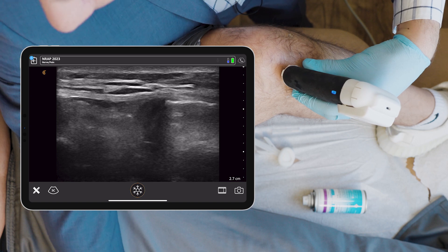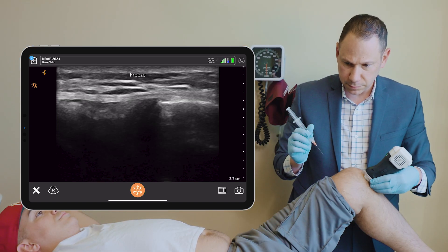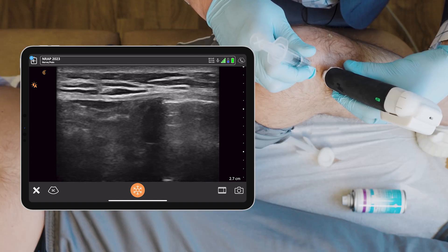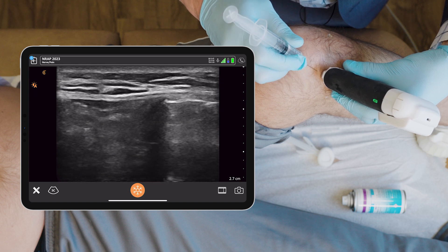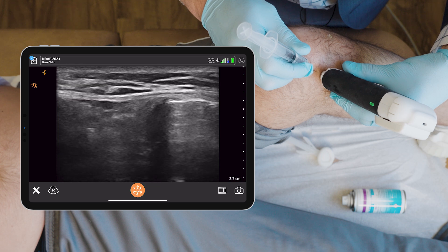I'm going to first spray him. I'm going to get you a little pinch. Hurting you a lot? And we're right there.